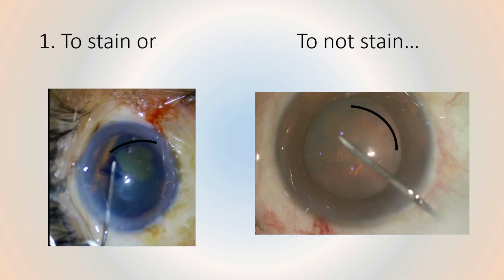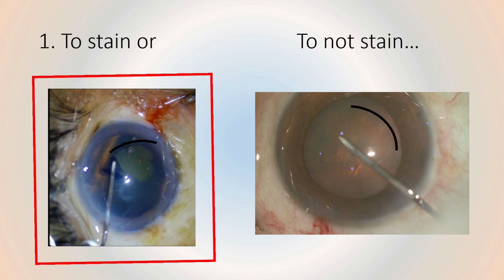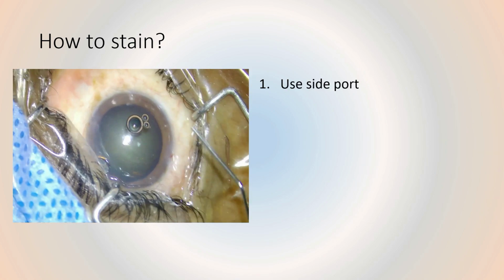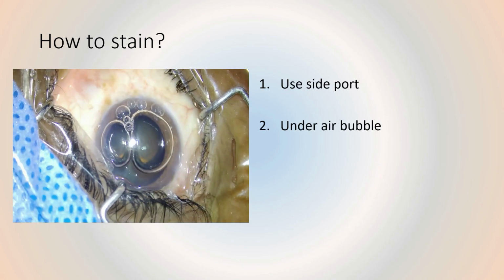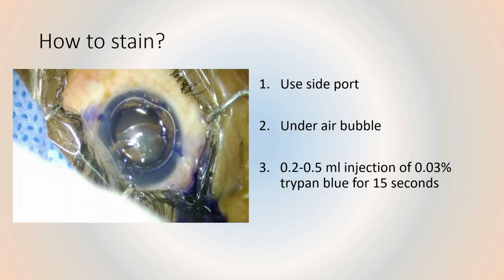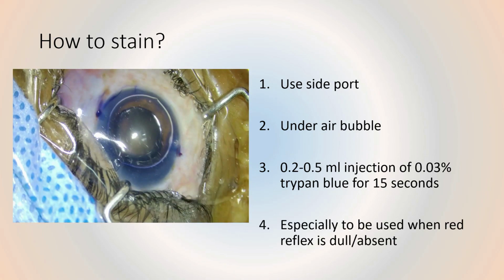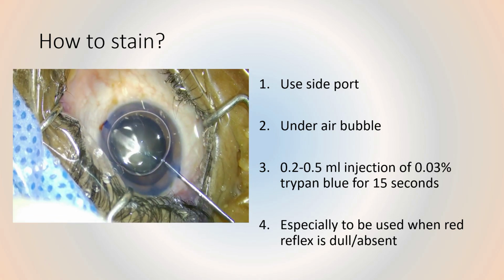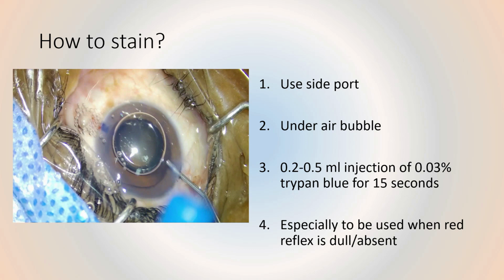As beginners, there will be lots of questions. First one would be to stain or not to stain. It's pretty obvious that to stain would be the way to go. How do we stain it? Use the side port, under an air bubble. A 0.2 to 0.5 ml injection of 0.03% trypan blue for 15 seconds, especially to be used when the red reflex is dull or absent.